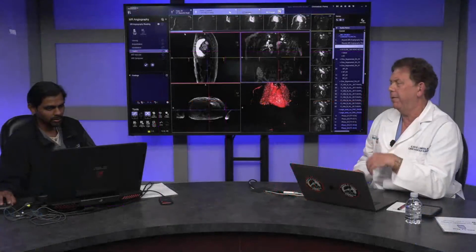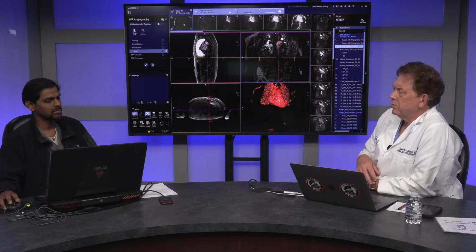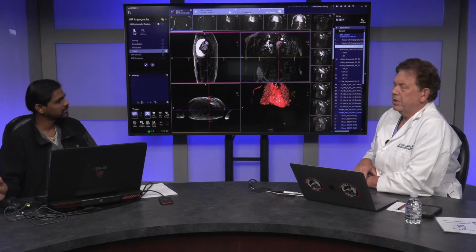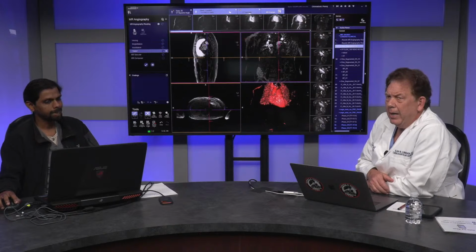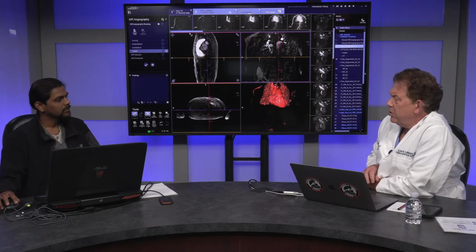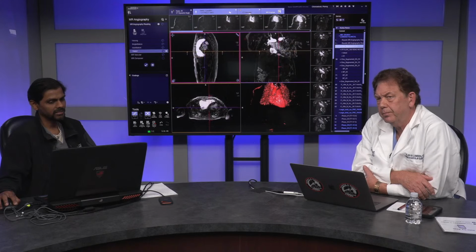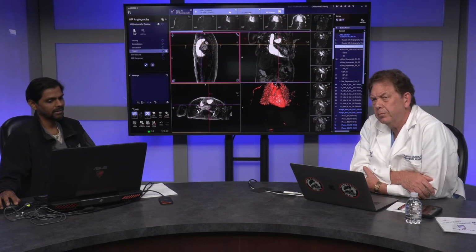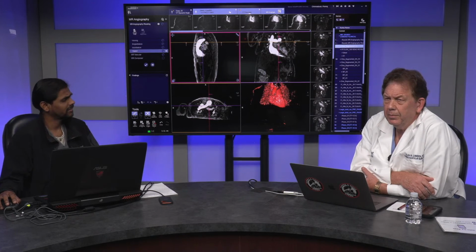The protocol itself is commercially available, but ferumoxytol is not really indicated as a contrast agent. We use it a lot. Any patient with elevated creatinine that we want an MR on gets a ferumoxytol MR. I've not seen it widely used elsewhere. We do it in probably 20-30% of the MRs that we get. Most often the routine use is gadolinium, and not many people have adopted ferumoxytol, and I don't think it is available commercially in Europe, for example.